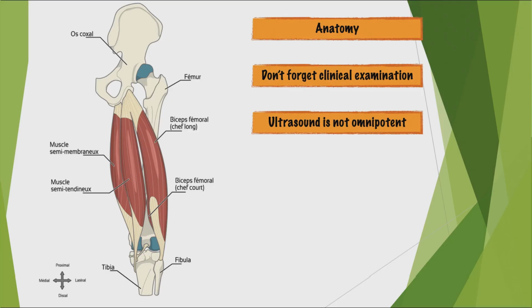But I really think that on obese patients, you should always keep in mind that the low-frequency abdominal probe, and they've come a long way in recent years, can help you make diagnoses. I can't count the number of times I've managed to diagnose proximal phlebitis of a lower limb in a very obese patient with very large legs, thanks to the abdominal probe, while the linear probe, which is normally the probe used, was of absolutely no use. The image was absolutely catastrophic. So remember, when you're in trouble, to use the low-frequency probe, even if you would naturally have used a high-frequency probe.